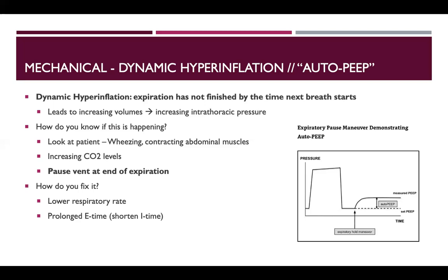I think another example that Dr. Jafari mentioned clinically was, if it's really, really bad, you can just disconnect the patient and push on their chest and help them get all the remaining air out. But that's just another example.